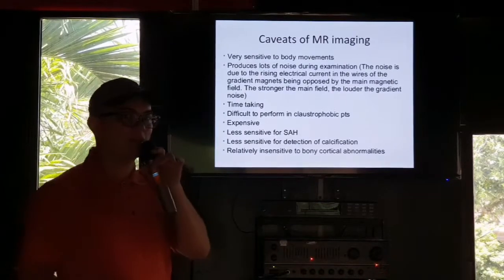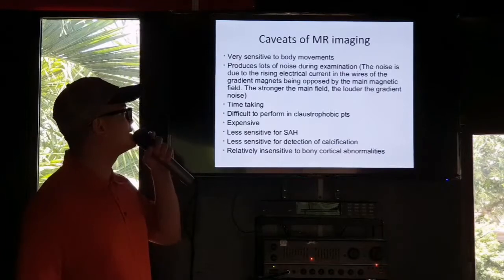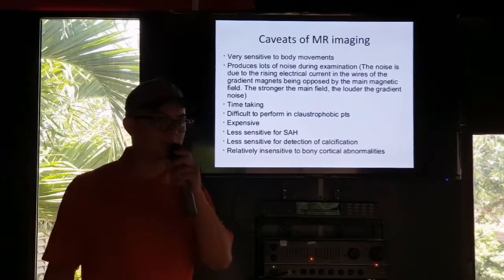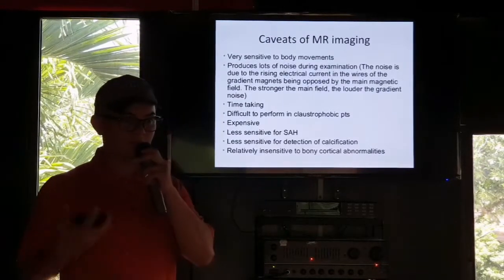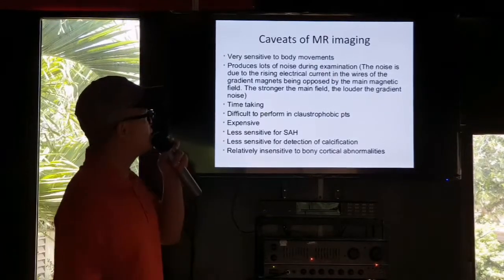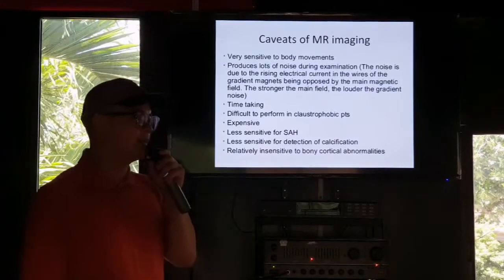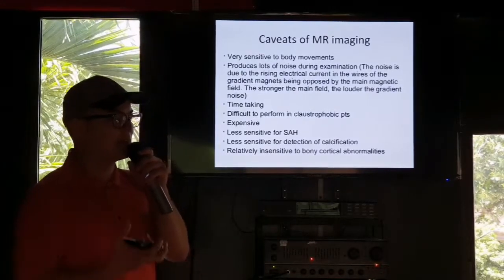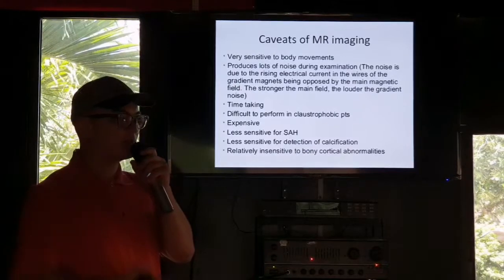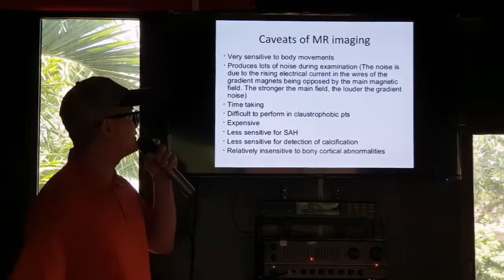What are the caveats of MR imaging? Of course, it is very sensitive to body movements. So remember, there's movement of protons during body movements, and one of the weaknesses of MRI is that because it takes a long time to form the images on a computer, it is sensitive to body movements.